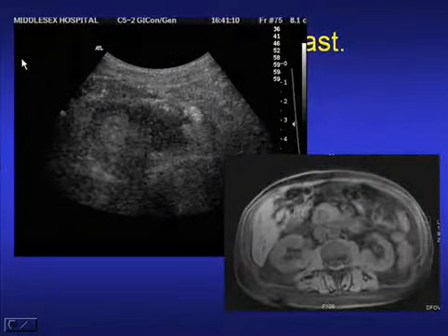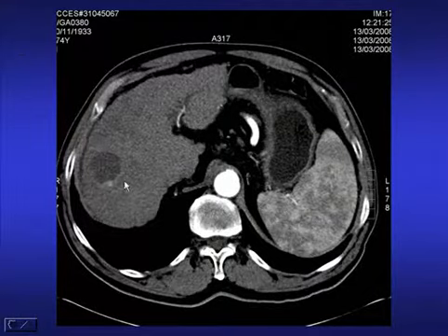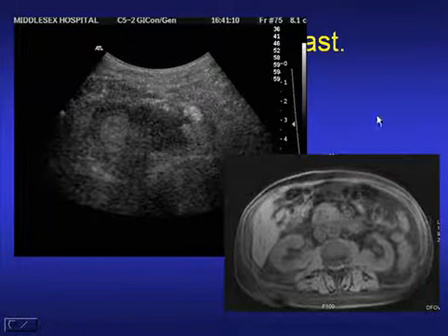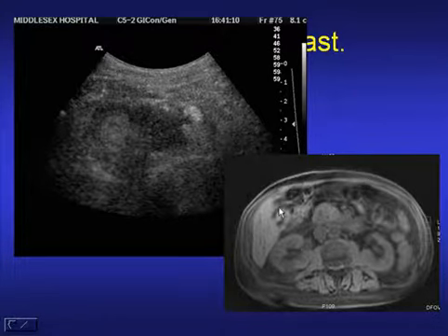We can use this quite effectively with ultrasound contrast to control the effectiveness of our radiofrequency ablation and pick up quite small nodular areas and determine whether or not there is residual tumour which we need to go back and treat. So in my practice now, ultrasound contrast is fairly routine in liver imaging, wherever we're trying to detect or characterize focal liver lesions, and particularly for controlling biopsy or radiofrequency ablation techniques.